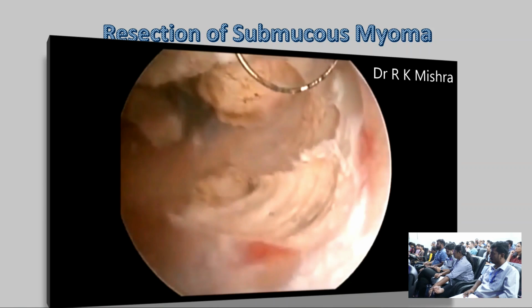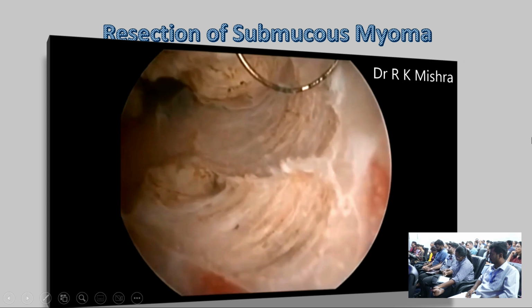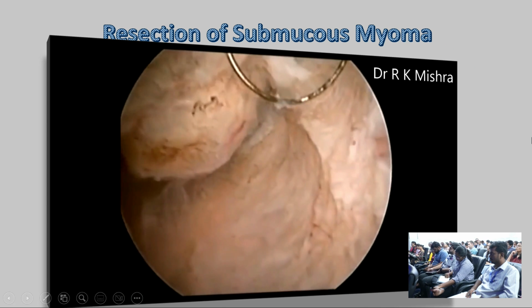Why? Your azimuth angle is 0. Azimuth angle means the angle between telescope and instrument is 0. Those are parallel. So always be careful that the texture should never be darker than the surrounding, otherwise you are digging, and then you will enter the venous plexus and bleeding starts.